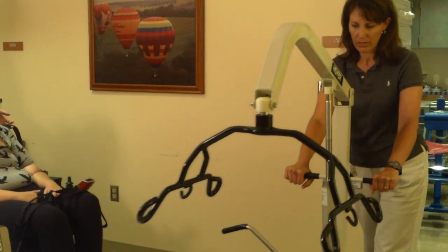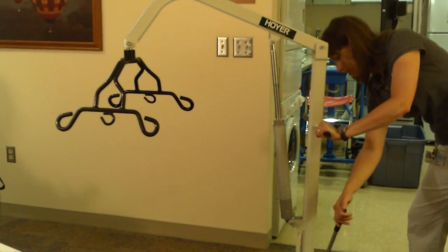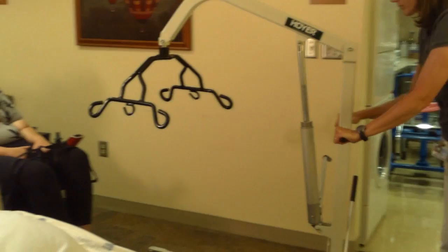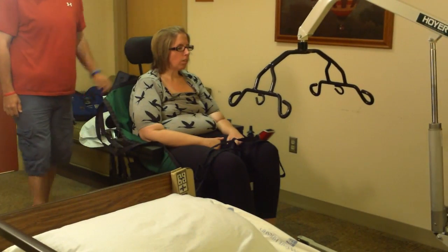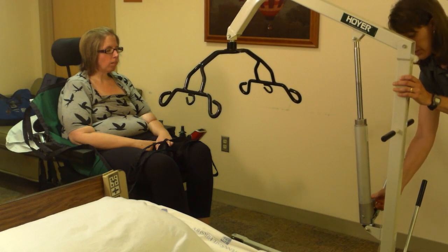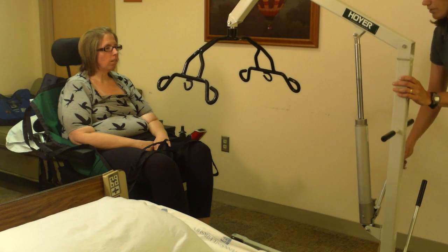You want to make sure that your Hoyer lift goes under your bed. In case you need to, you may have to move things out of the way or raise the bed as needed. You want to spread the legs of the Hoyer lift so that they come on either side of the wheelchair. You want to make sure the knob is tightened so that you can lower or get the piece up.